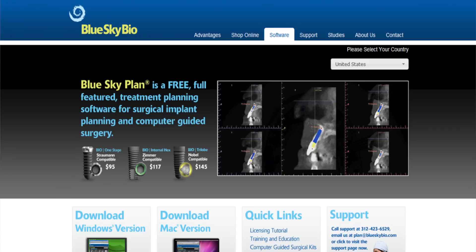Once the plan is complete, the case is registered on our website and the plan is sent to us online. Since Blue Sky Plan software is free, we have found it to be helpful for our restorative partners to download the software so we can collaborate on the surgical plan. We will send you a drill guide and a set of drill stops customized for your drills, regardless of implant system.